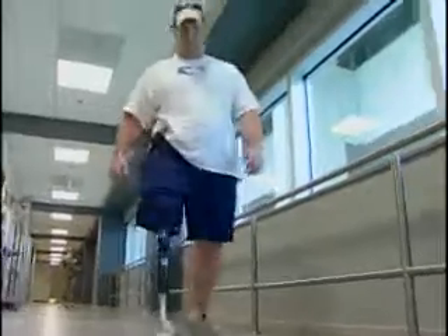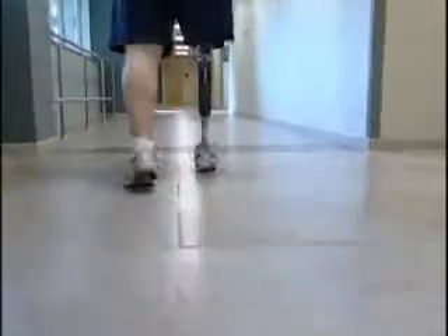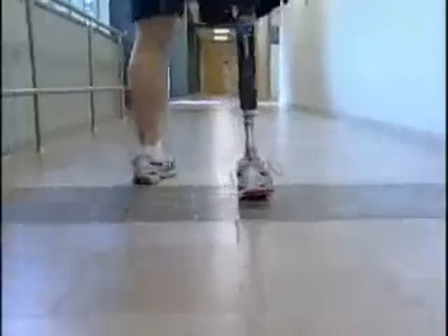A year from now, I'd like to get back to deploying downrange. Even though I might not be able to do everything physically like I used to, I still got it up here. And now, thanks to the prosthetists at Walter Reed, he's got it down here too. Crystal Park, Washington.